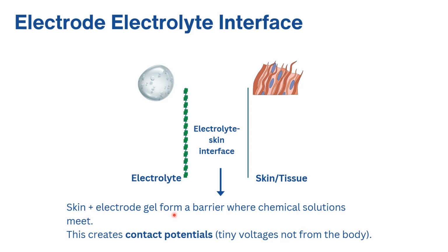by a small thin barrier, in our case it is the skin. So there will be electrode, which is a gel, and there's a skin. Beneath the skin there will be some kind of a liquid medium, right? So this liquid medium will have loosely packed ions, gel has loosely packed ions, so these ions will try to jump from this layer to this layer, and that jumping is supported by the skin, right?